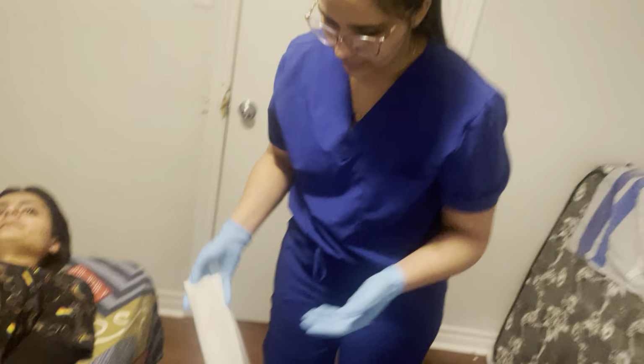So now we are going to assess the old dressing for any kind of drainage. On the old dressing, we can see that there is a small amount of serosanguinous fluid, but there is no active bleeding, no pus is present. We are going to discard this old dressing.